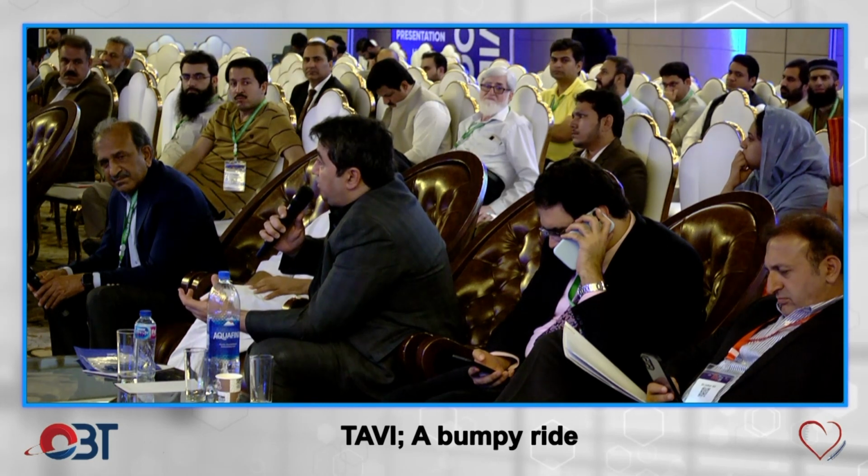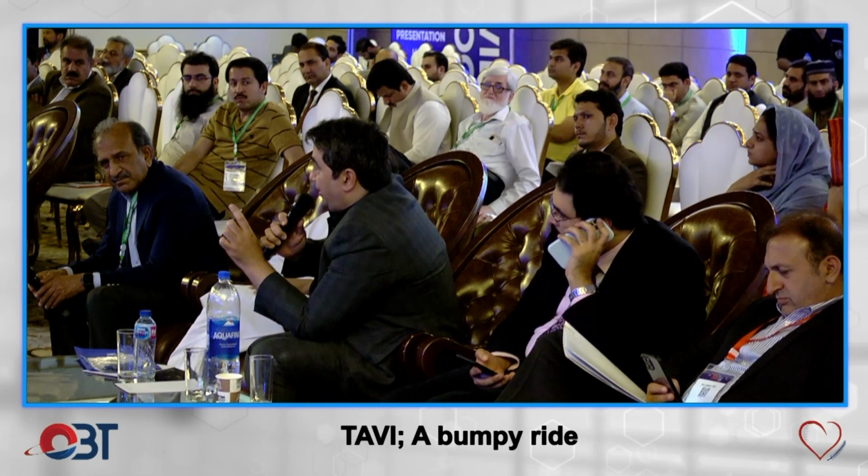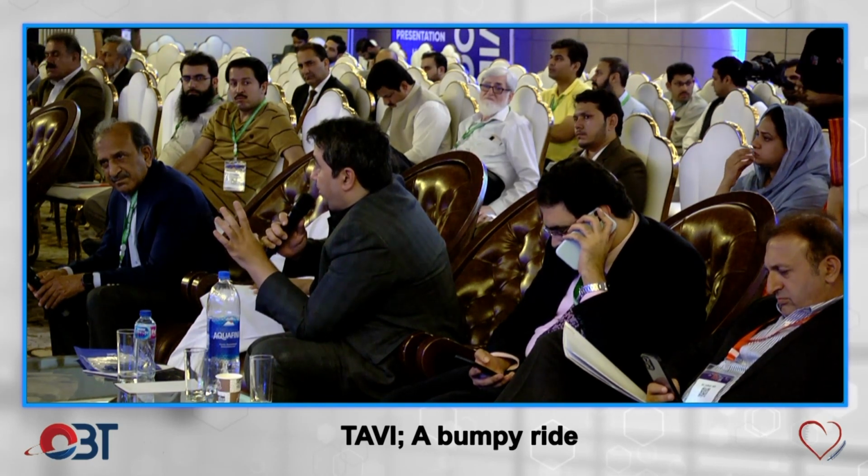A couple of other things: your balloon length wasn't big enough. I think it was a 30 millimeter length. It was a 40 mm. 40 was what was available in the inventory.